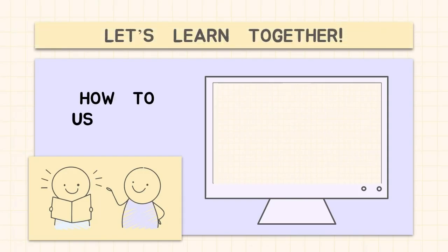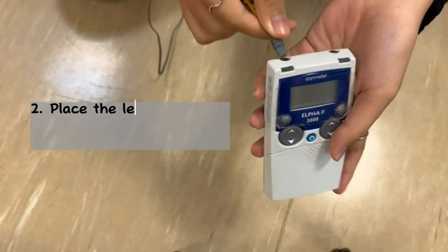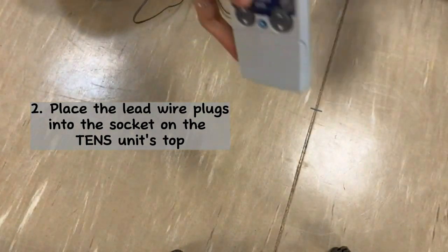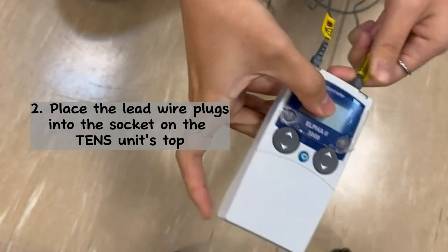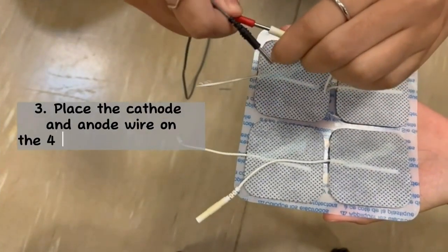Let's learn together on how to use TENS. First, make sure the TENS machine is turned off. Second, place the lead wire plugs into the socket on the TENS unit top. Third, place the cathode and anode wire on the four electrode pads wire.